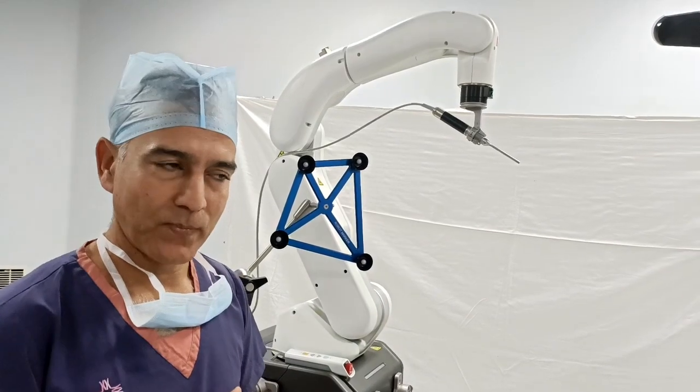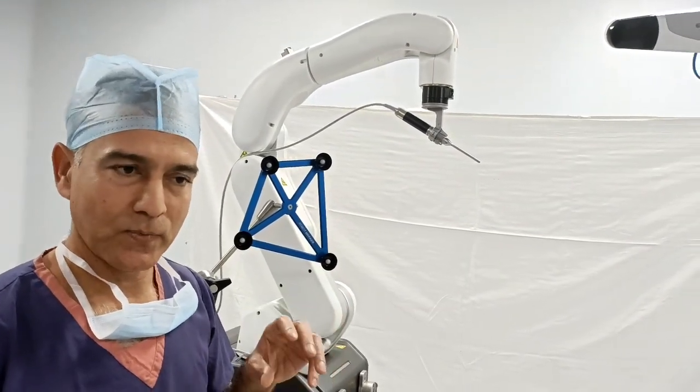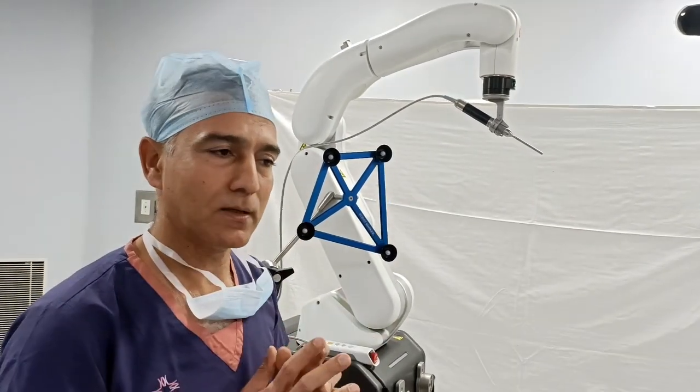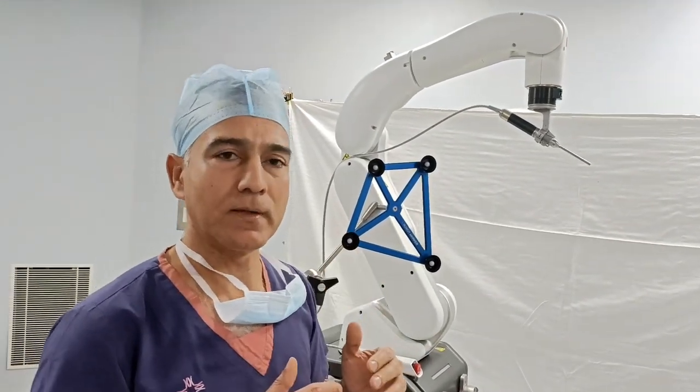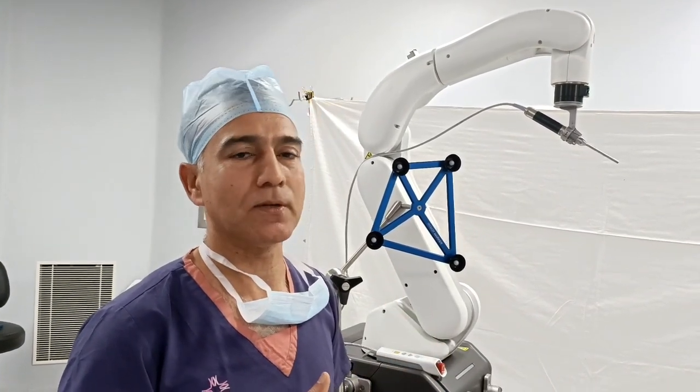This robot is with us now. We will feed any picture of the patient's bone, and we will give any information. We will achieve accuracy up to less than 1 mm, so we will get the best results.